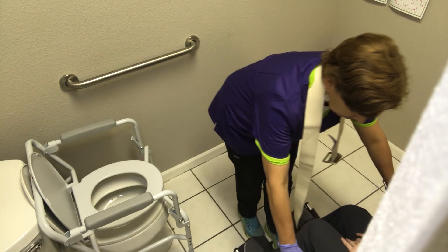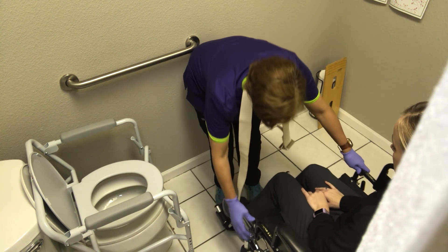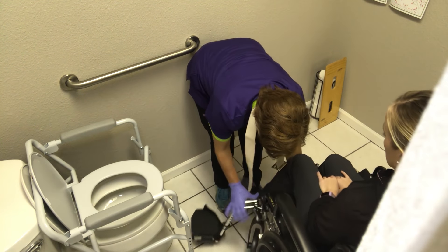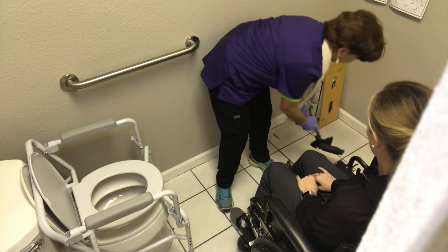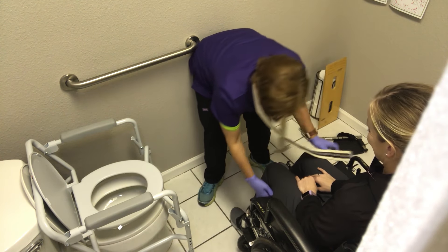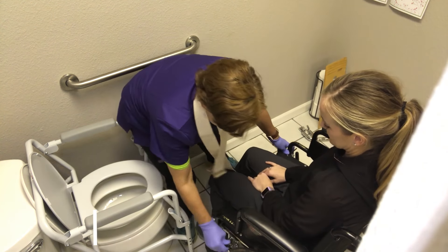We're coming in with someone who needs a little bit more assistance. I'm going to get as close as I can, take the footrest off, get the tops off, get a little bit closer here, and then I'm going to put the brakes on.